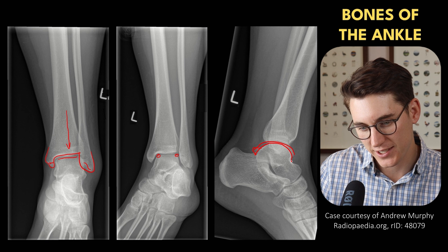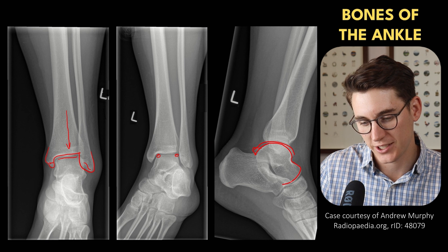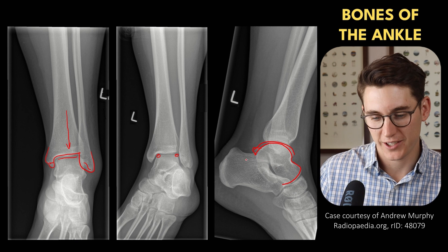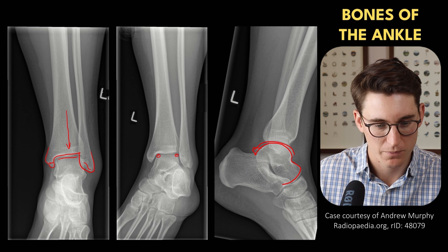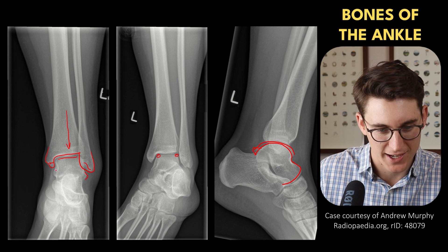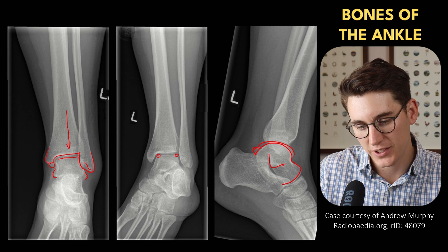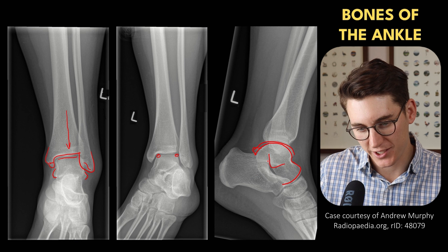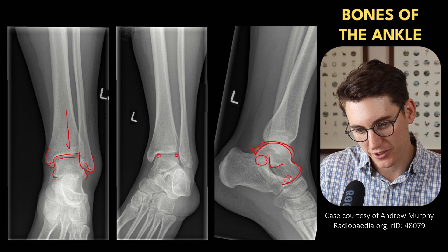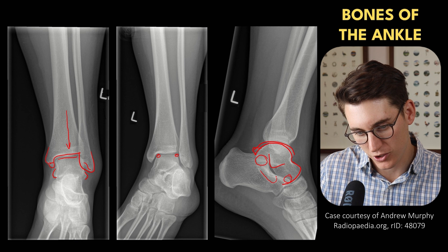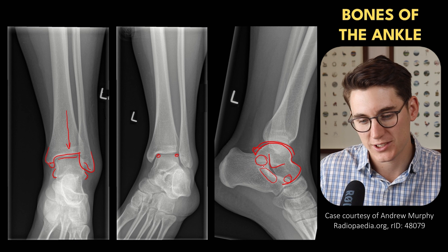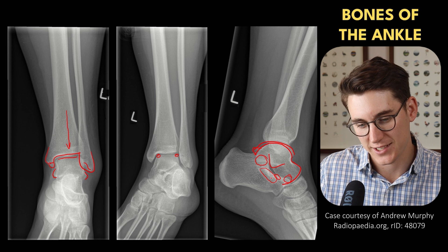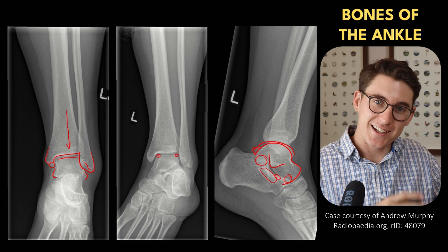Anteriorly, we've got the neck of the talus heading into the head of the talus, which has this anterior articular surface where the talus articulates with the navicular. The talus sits on top of the calcaneus. We can see both a lateral process and a medial process of the talus, and our lateral process makes this V-shaped mark on our lateral x-ray. The talus articulates with the calcaneus with a posterior facet and an anterior facet, and you can see a sclerotic margin which is an outcropping of our calcaneus known as our sustentaculum tali. There is also a joint between the talus and that sustentaculum tali, which extends out underneath the talus.